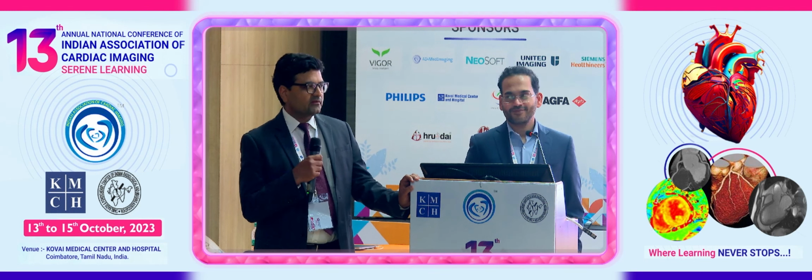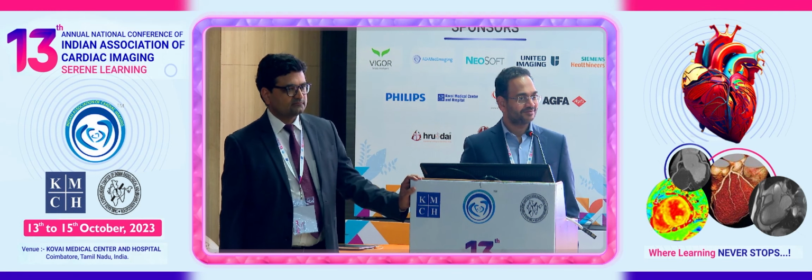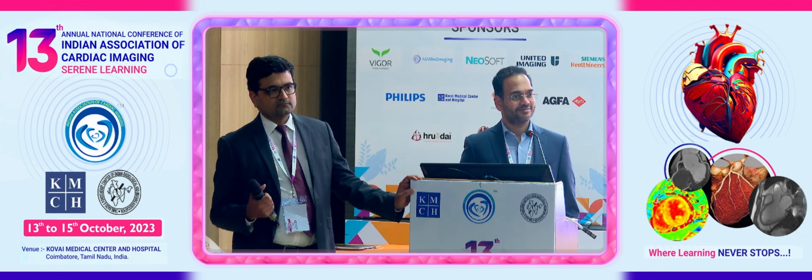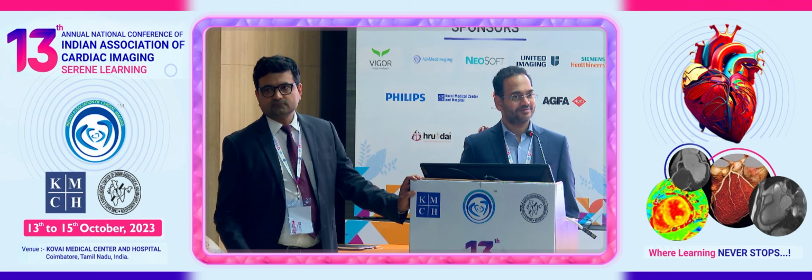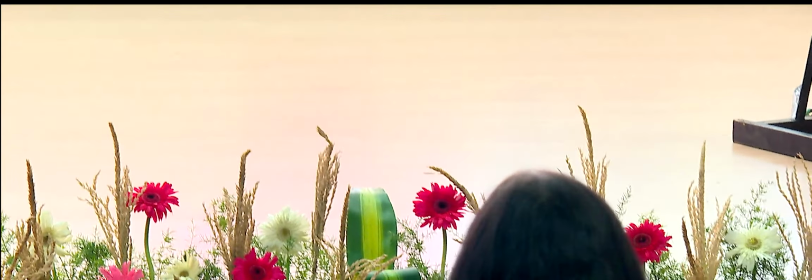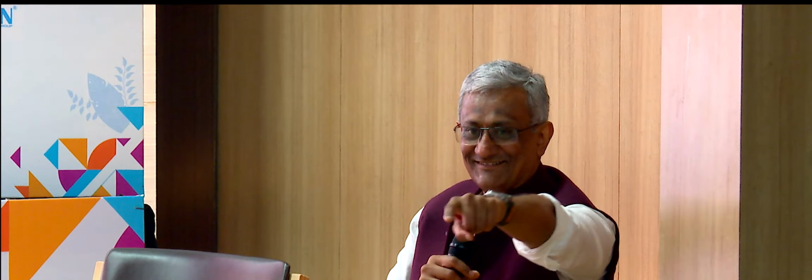I think guidelines say you should consider a statin. That is the whole role of calcium score. The point is it doesn't matter what the heart rate is, because you want to know whether it is 0 or not. It's in the low risk variety. If you have an absolute 0 calcium score, it only improves your risk stratification of a patient. Even with 5, you can't put a 5 and an LDL of 120 on statins. No, because if you have 5 calcium, that means there's a lot more non-calcified plaque inherently inside it. Are you never going to bring in a CTA? Rajesh, you have a question, sir.